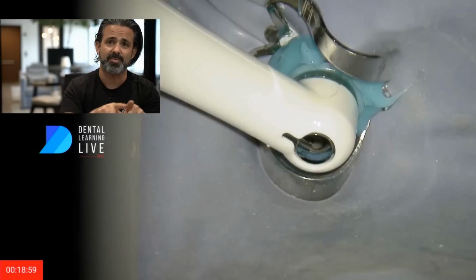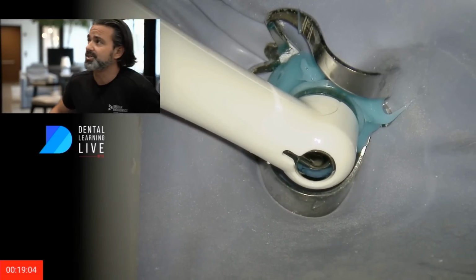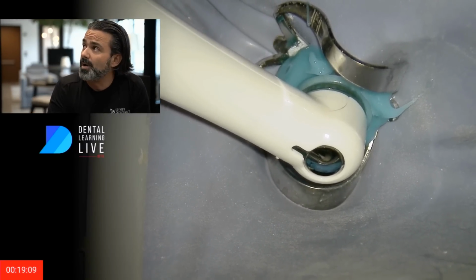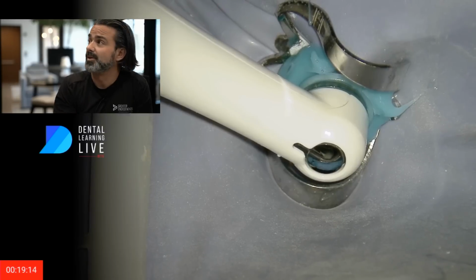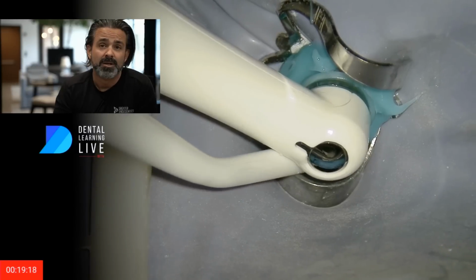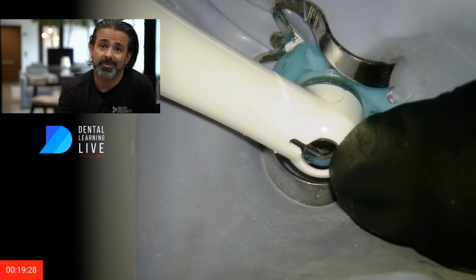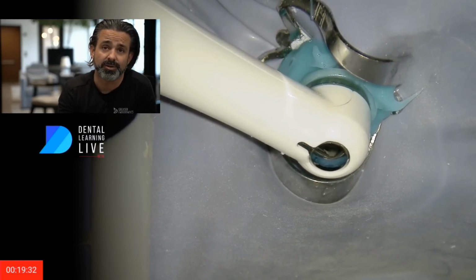It kind of felt like perhaps they were coming together. You get that feedback in those files as far as the directions it's going, but I wasn't quite certain what it was doing. So hence the reason I think it's just completing like a circle, going around in there inside the root as far as the anatomy. So for me, I'm almost done here, and then I'm going to have to check my lengths, figure out where we are, and see if that's going to work.